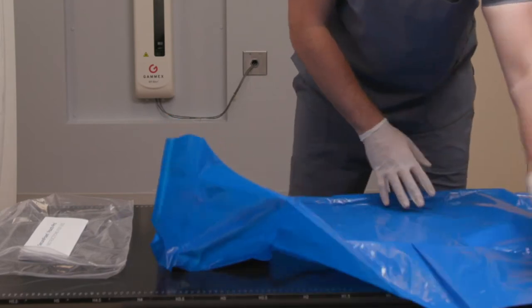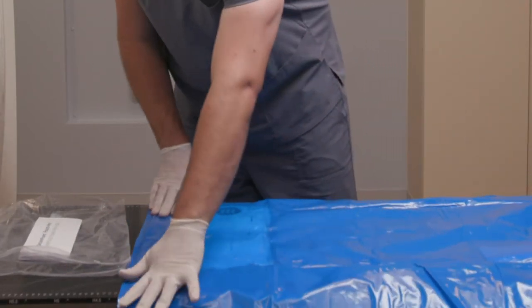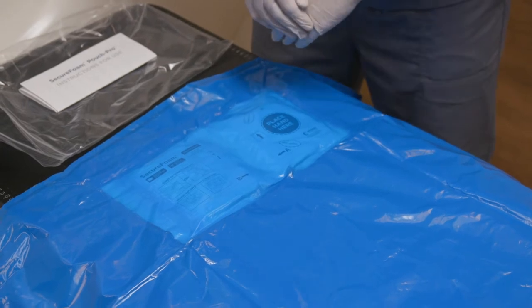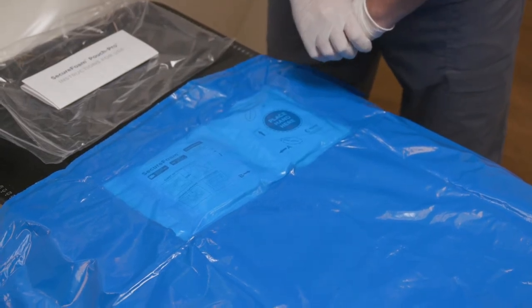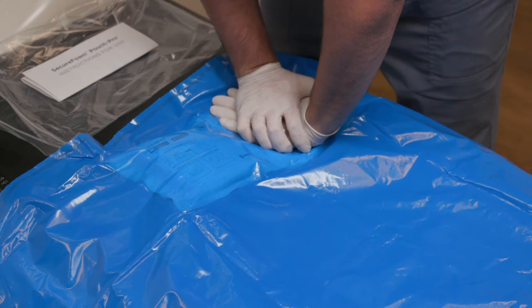Prepare your treatment table by unfolding the large plastic foaming bag in front of you. To burst the pouch, place two hands, one on top of the other, on the area marked Place Hand Here. When you're ready, push straight down with both hands until the middle seal breaks.